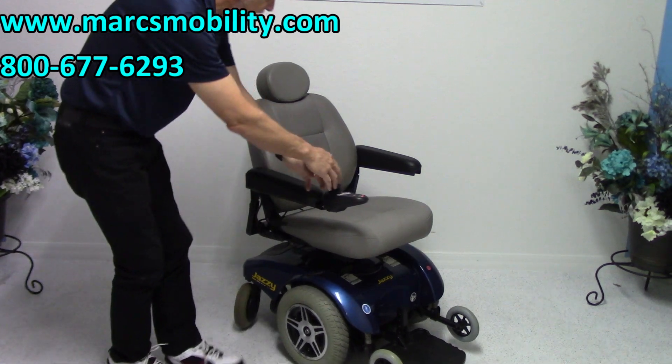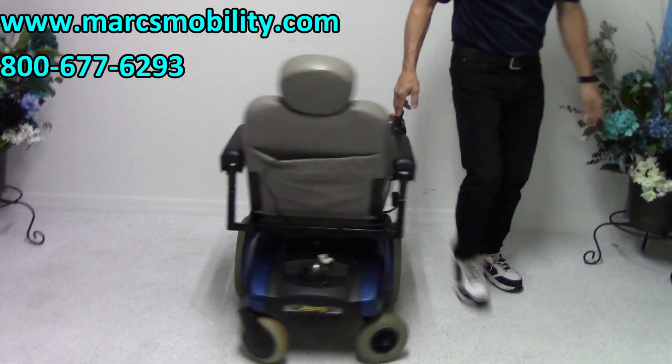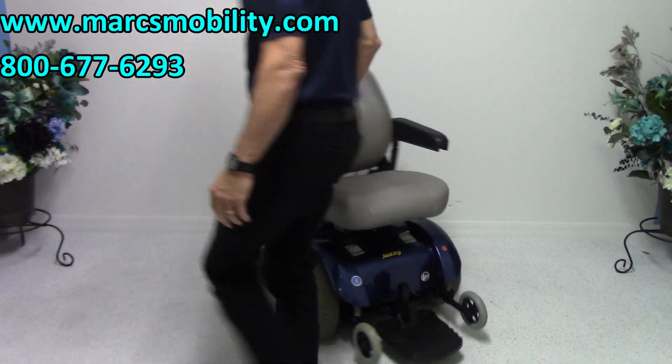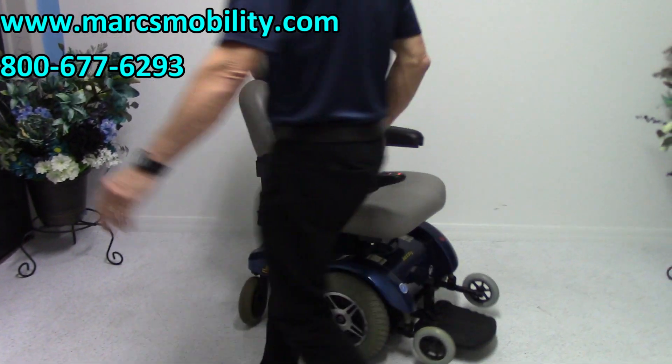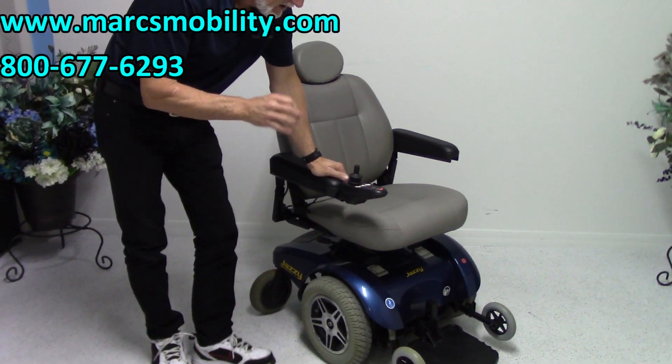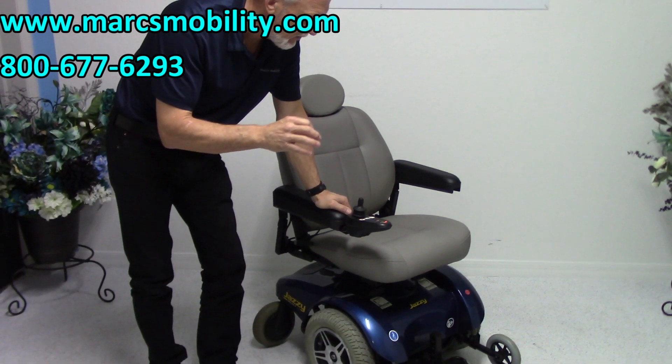It has a very good turning radius — it turns really nicely. It has a 300-pound weight capacity. It takes two batteries; with the 55-amp batteries, you'll be able to get 15 to 20 miles per charge.